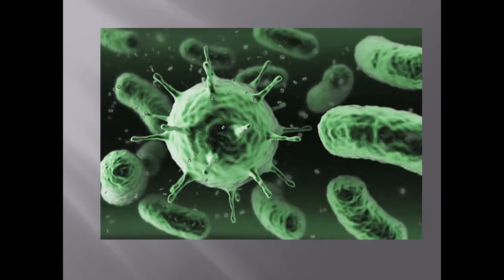Our hypothesis was that Eve had the cleanest mouth, and then Sam, and then Jazz. We chose this hypothesis because we used Eve in our last experiment, and she had the cleanest mouth out of the human, horse, dog, and pig. Jazz lives outside most of the time and is open to anything he wants to eat. We swabbed each dog, and then after feeding them the same food for 4 days, we swabbed them again.